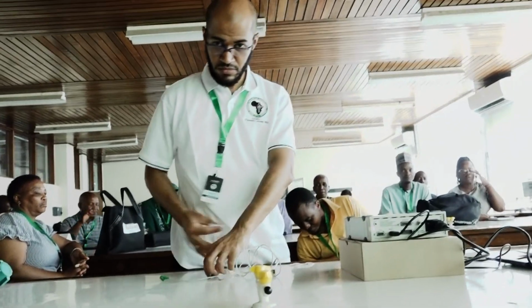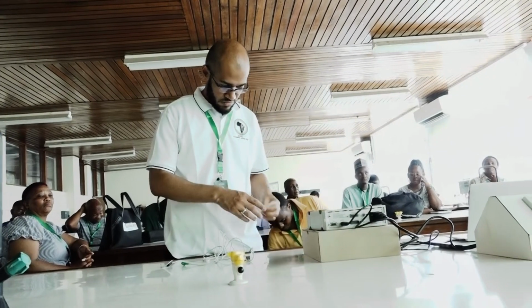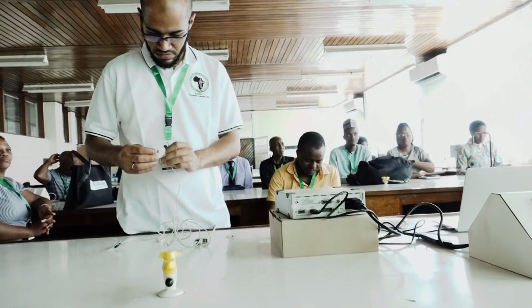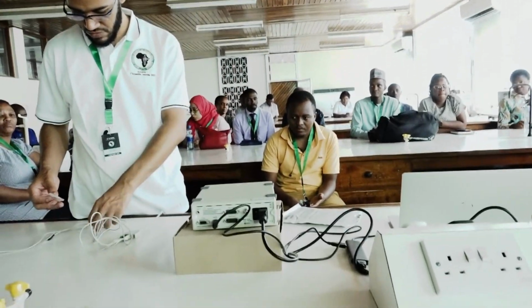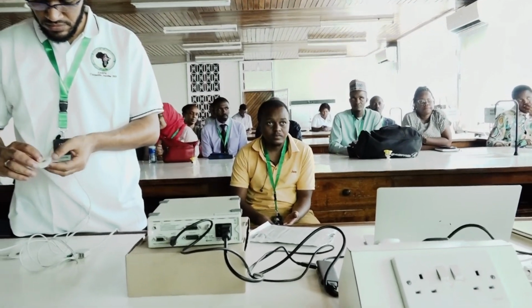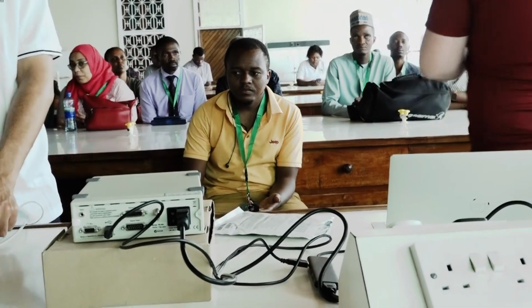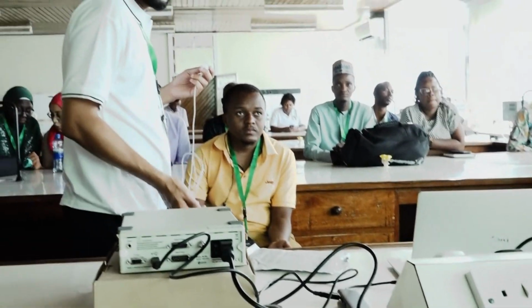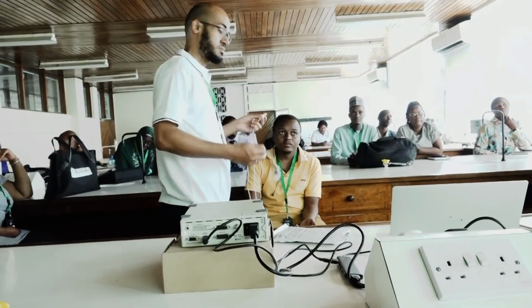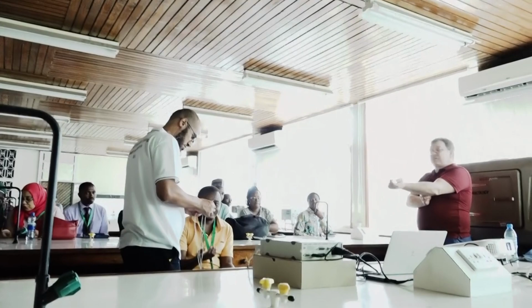The right one that he's just preparing is used for bioamplifying biosignals, so biopotentials: EEG, EMG, ECG, EOG, so eye movement and so on. And these two in between, the red and the black one, this is a stimulator, so you can basically stimulate the student by placing an electrode, let's say here, and stimulating the nerve.